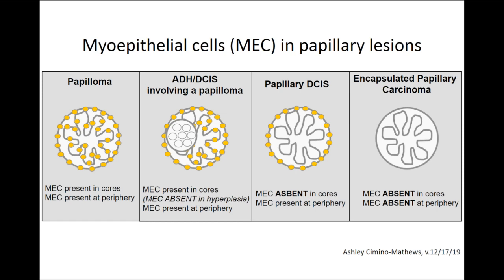And let me ask, I think the most recent one is, can solid papillary carcinoma and invasive papillary carcinoma be different? If yes, how do we differentiate? So can solid papillary carcinoma and what was the second entity? And invasive papillary carcinoma. Yes. Solid papillary carcinoma and invasive papillary carcinoma are different.